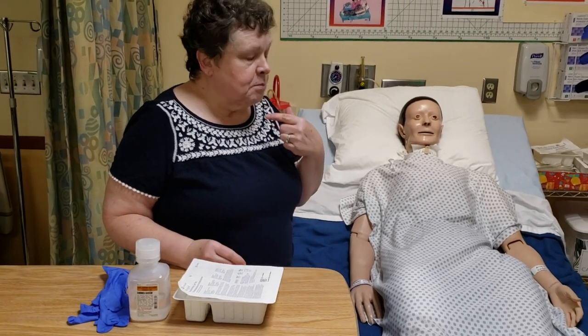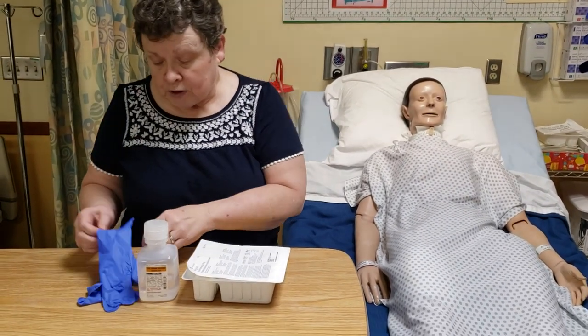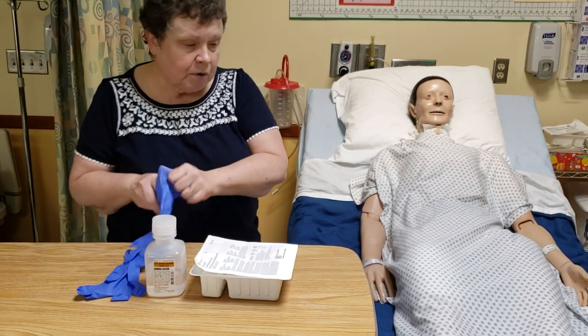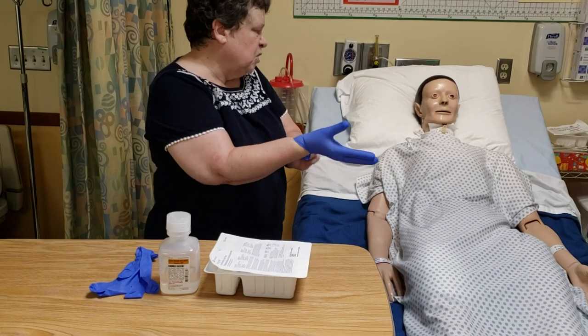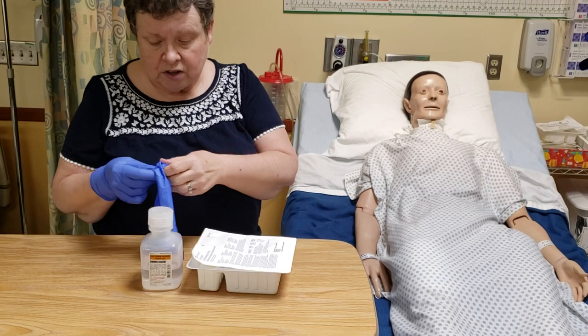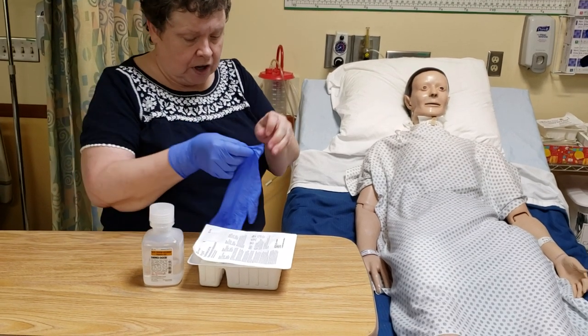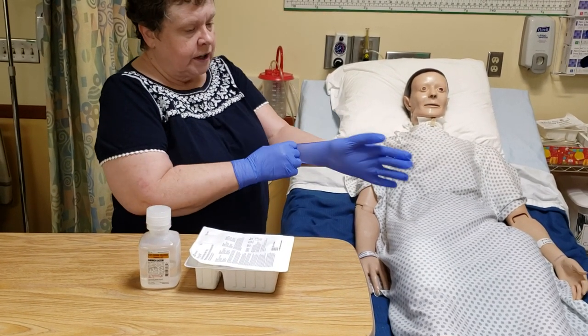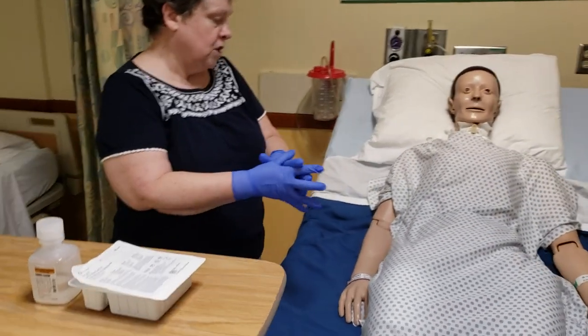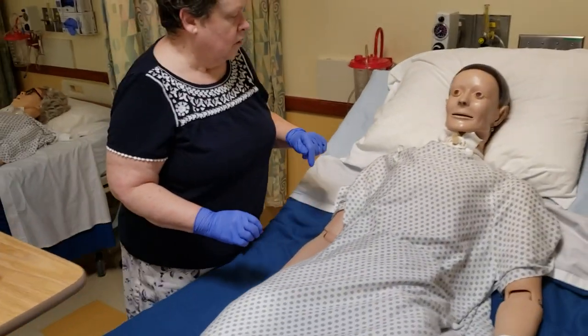If it's a newer trach, it might be pretty bloody with lots of drainage. If it's an older trach, you're probably just going to have a lot of mucus and saliva around the trach area. Go ahead and put your clean gloves on. I would have done my hand hygiene and checked my patient — all those good things we did before.